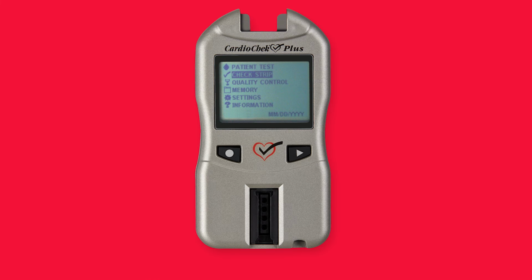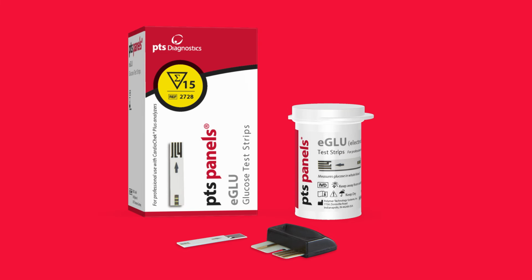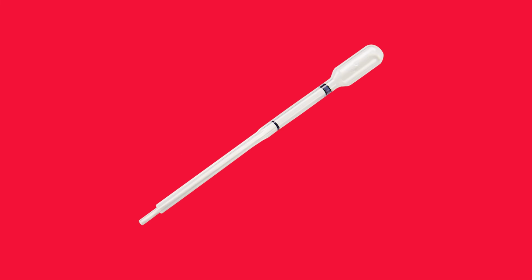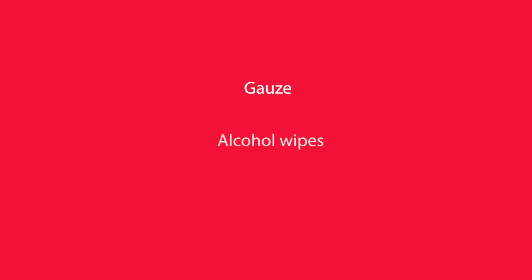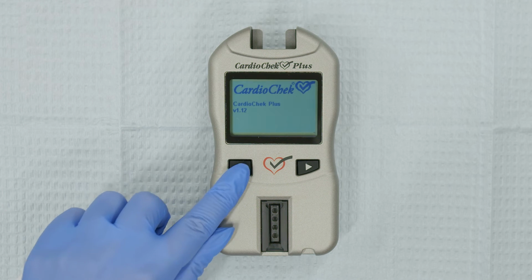Then, gather all the items you'll need: analyzer, PTS Panel's lipid panel test strips, PTS Panel's eGLU test strips, memo chip, lancet, PTS Collect capillary tubes, 40 microliters, gauze, alcohol wipes, biohazard container. Perform a 3-point check. Turn the analyzer on by pressing either button.